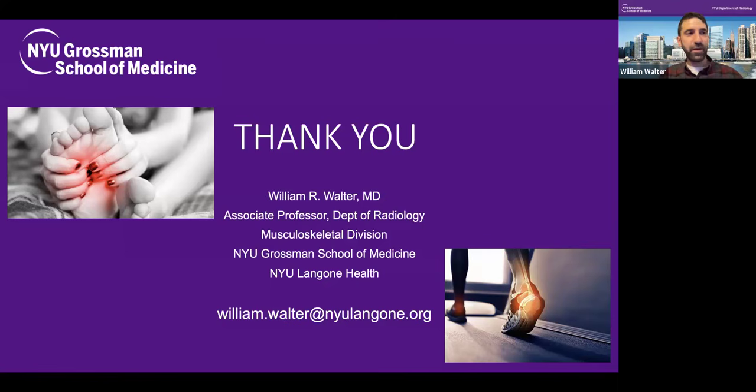For the alignment, I think weight-bearing X-rays are still the gold standard. Don't mess around with weight-bearing MRI to do that, because the alignment is shown so well on X-ray. I think that's still the standard that everyone will use and be familiar with. So weight-bearing X-ray and then MRI. MRI will show the status of the ligament complex, of course. It's also very sensitive for fractures.